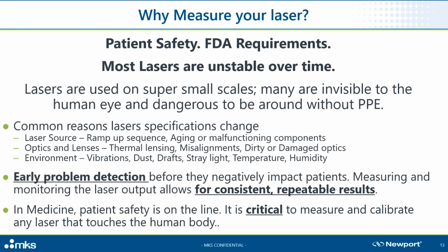Okay, so why measure your laser? For the safety of the patient, and it's the law. The FDA regulates both medical and non-medical lasers. They require a NIST traceable calibrated power measurement at least once per year.